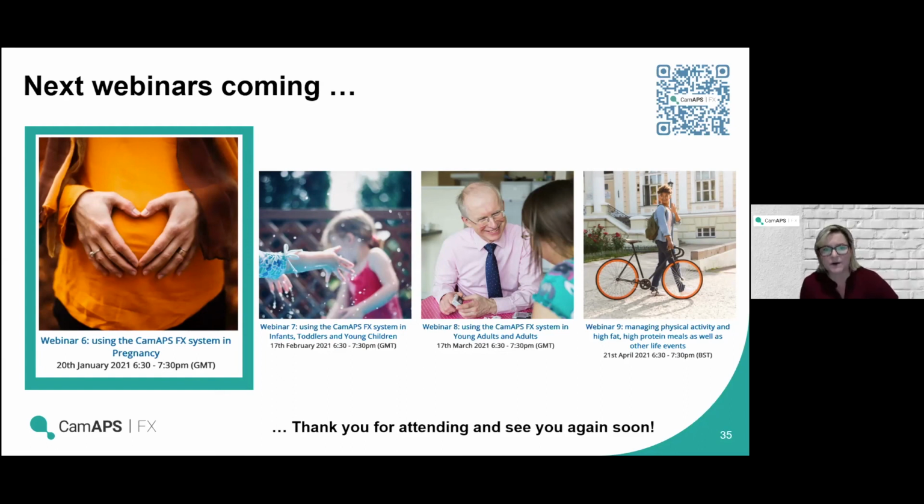It's a similar question. Somebody is saying raising the targets for recurring periods of hypo at a specific time is a really good idea. I guess there's logic that the hypos will stop within a day or so of doing that. And then is it correct to gradually bring it down to your original target? Is that right? Yeah, I think so.